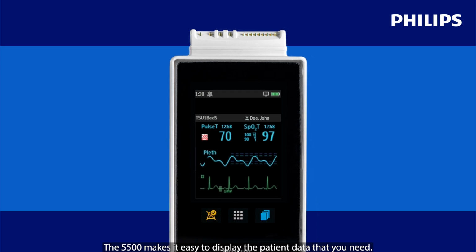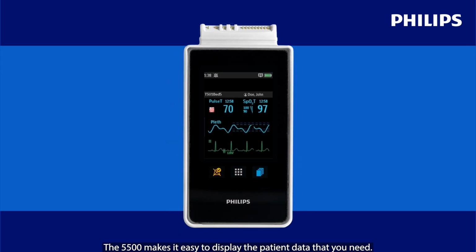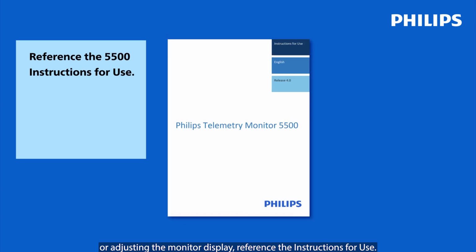The 5500 makes it easy to display the patient data that you need. To learn more about applying electrodes, the SpO2 sensor, or adjusting the monitor display, reference the instructions for use.